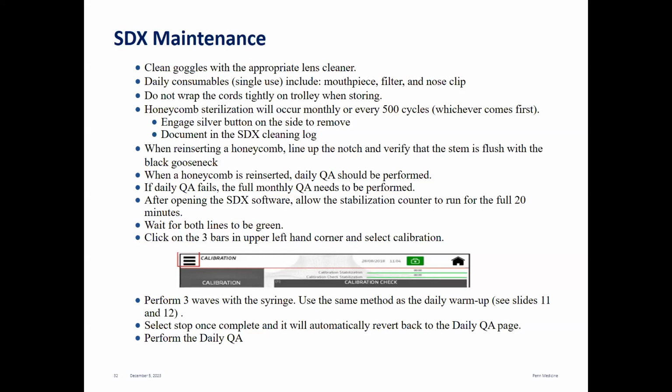We document the SDX cleaning in a log. When reinserting the honeycomb, you have to line up the notch and verify that the stem is flush with the black gooseneck. When the honeycomb is reinserted, the daily QA should be performed. If the daily QA fails, the full monthly QA has to be done.